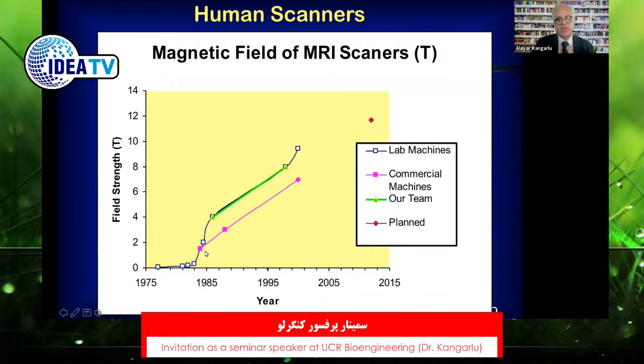So in 1985, the standard of business was this, where MRI actually came into the world of medicine. For some reason, all the 3 major manufacturers, GE, Siemens, and Philips, decided to make 1.5 Tesla the standard of operation for clinical scanners. And then there were a few 4 Tesla scanners at that time. I think Minnesota was one, University of Alabama was another one, and a couple of 4 Tesla scanners in Europe and Japan. But for a long time, 4 Tesla remained the standard of research scanner field strength, and the 1.5 Tesla the clinical standard.